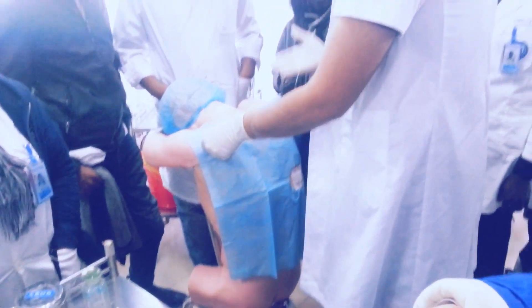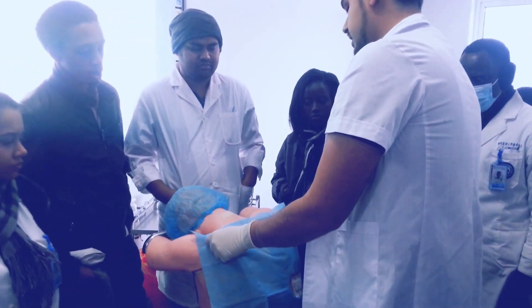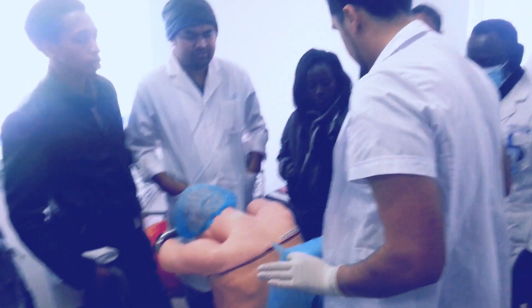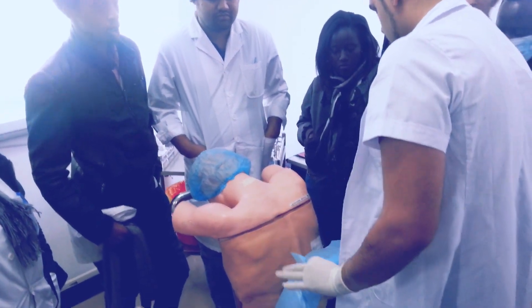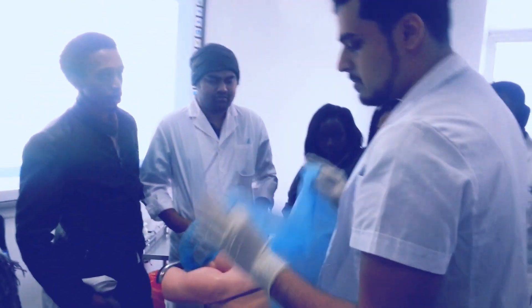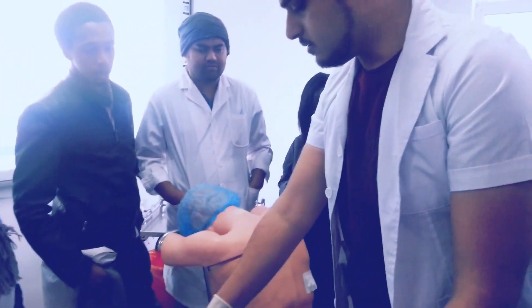And when you are taking off the equipment, you take it off like this because your hands are still sterile. You cannot touch the patient with your hands. Remember that please.